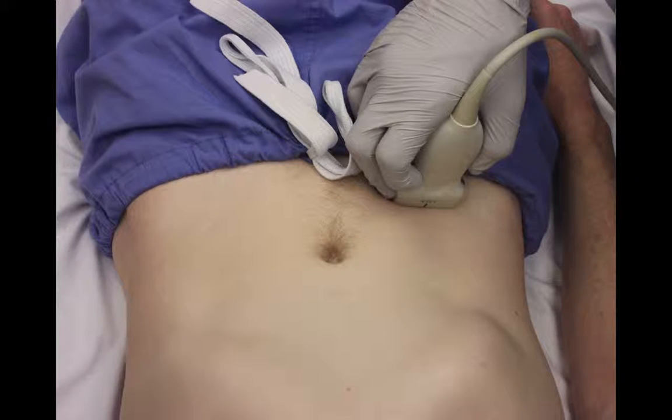If you ask the patient to point where it hurts and you put the transducer there but you don't find the appendix, there are a couple of other ways that you can look for it. The main landmarks are going to be the iliac crest, the iliac artery, and the psoas muscle. So I'll identify the iliac crest over here, and then I'll try and find the iliac artery and go up and down the iliac artery because oftentimes the appendix is just going to be sitting right on top of the iliac artery.